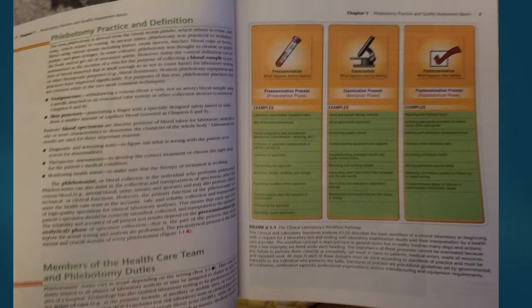For purposes of this text, phlebotomy practices that are covered relate to the two most common techniques. Venipuncture: withdrawing a blood sample from a vein, not an artery, using a needle attached to an evacuated tube system or other collection devices, covered in chapters 6 and 8. Skin puncture: puncturing a finger with a specially designed safety lancet to withdraw a smaller amount of capillary blood, covered in chapters 6 and 9.